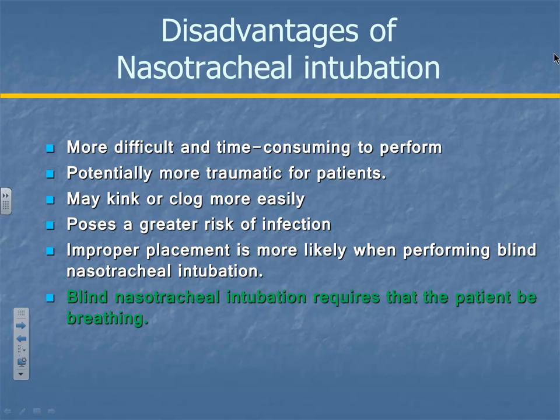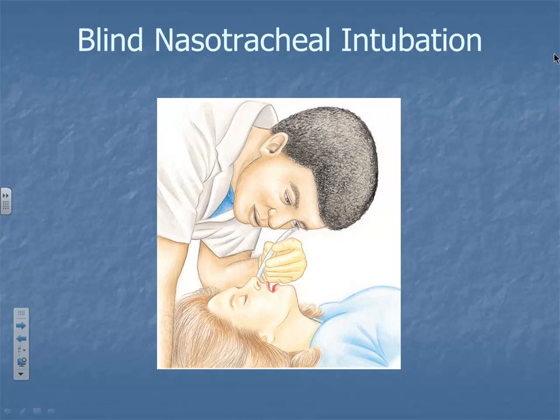Blind nasal intubation requires the patient be breathing. I don't know how many times I say that in class and people miss it on the test. They have to be breathing. And if their nose is really bad, then I'm not doing it. You have to do it the old-fashioned way. You wouldn't be able to get in there, would you? Probably not if it's real swollen. You'd be going like this, and pretty soon what's happening? So it's not always possible.